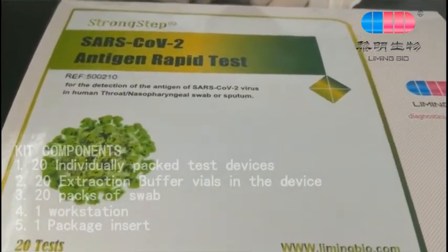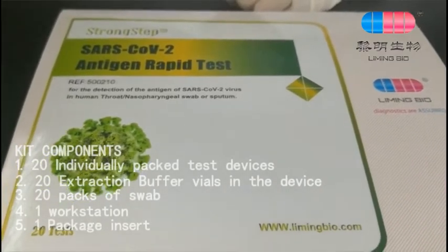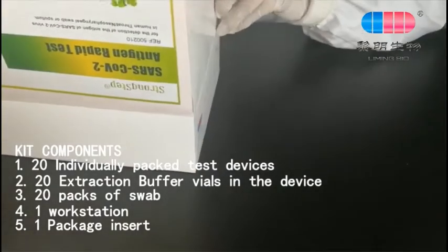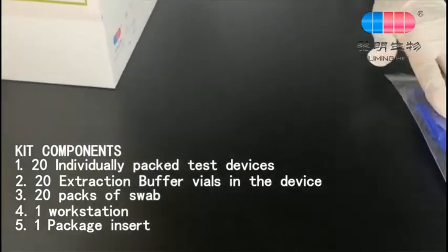Kit components: 20 individually packed test devices, 20 extraction buffer vials in the device, 20 packs of swab, 1 workstation, and 1 package insert.